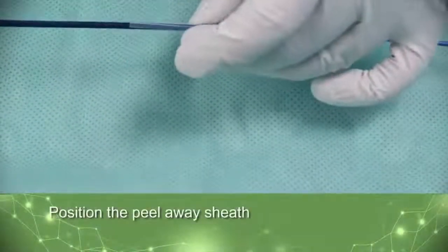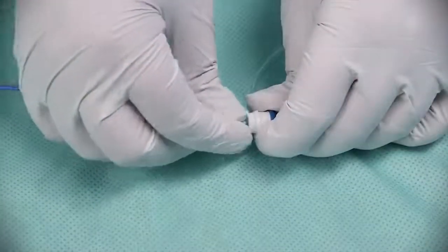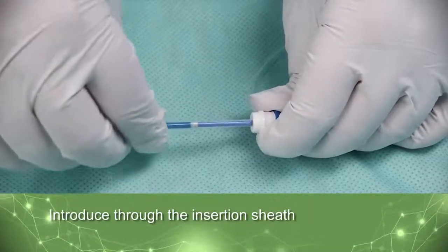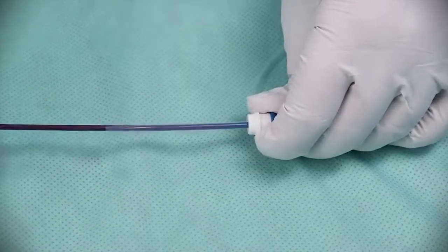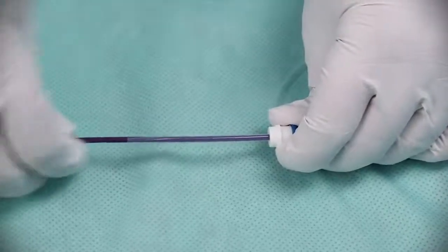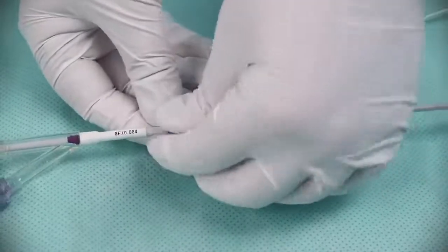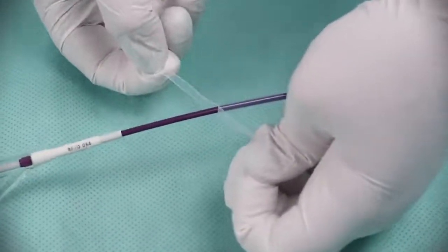Position the peel-away sheath over the balloon. Insert the balloon guide catheter assembly into the introducer sheath until the peel-away sheath meets resistance. Hold the peel-away sheath and advance the guide catheter into the introducer. You may either peel off the peel-away or move it to the proximal end of the catheter once introduced.